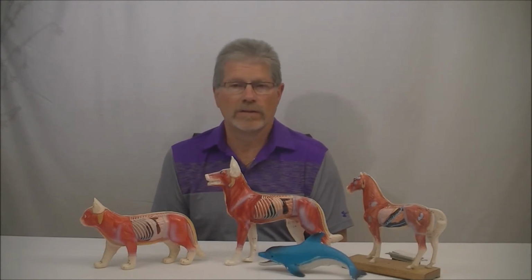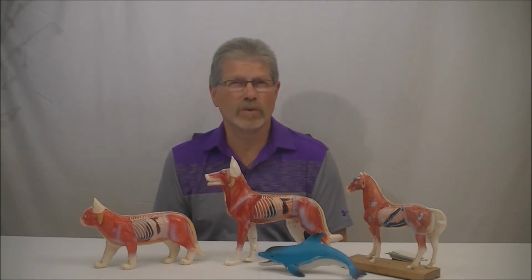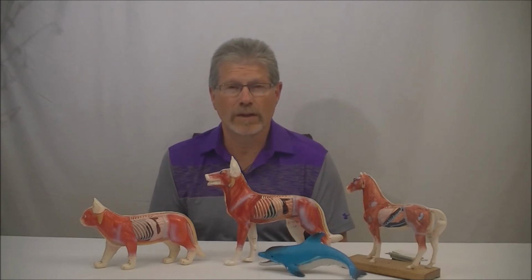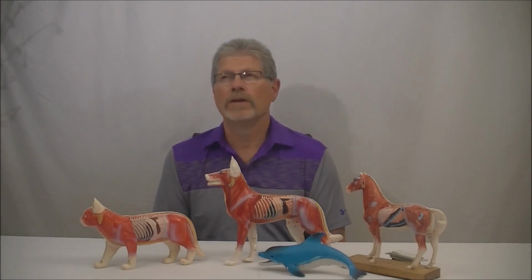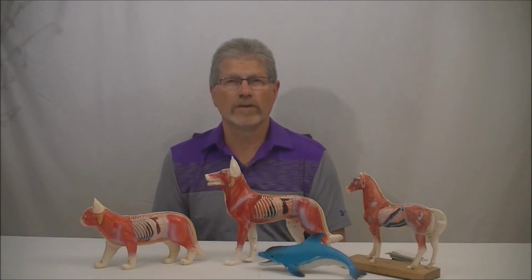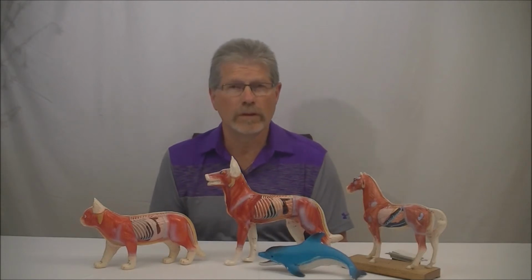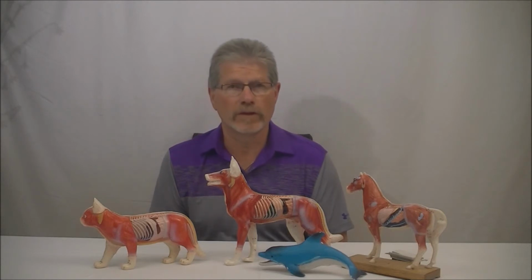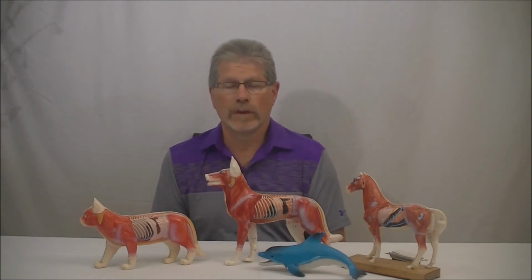There are cases where we've got hepatic issues, adrenal issues, diabetics, basically soft tissue organ dysfunctions that a class 4 is not going to touch. They're pretty much going to be directed towards wound healing, dermatitis, arthritic degenerative joint problems, and they can be quite effective at some of those.